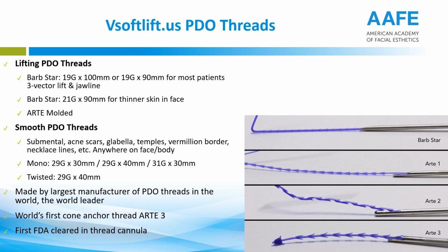All right, so let me talk about lifting threads here just a little bit. There are 2 kinds of lifting threads. We'll show you a quick case of smooth PDO threads later on for collagen biostimulation, but for lifting PDO threads, let's show you a couple of things here. There are 2 kinds: barbed and molded, pretty much. So again, these are the vSoft Lift. The top one is a barbed star, it's called, and you can see what it looks like. Those are laser cut barbs and those kind of prongs that come up. That's what attaches to that SMAS layer.